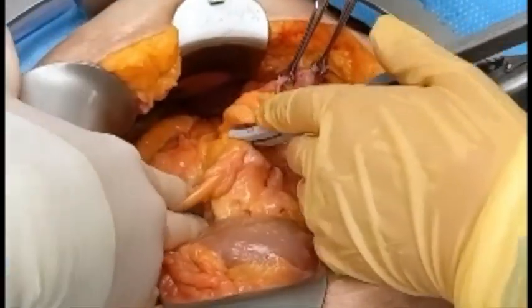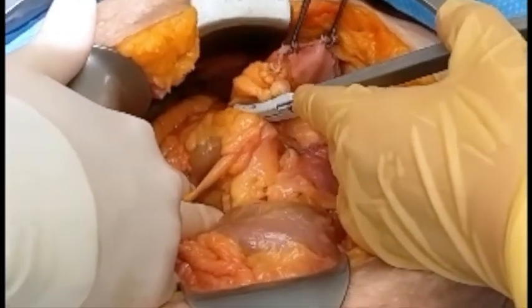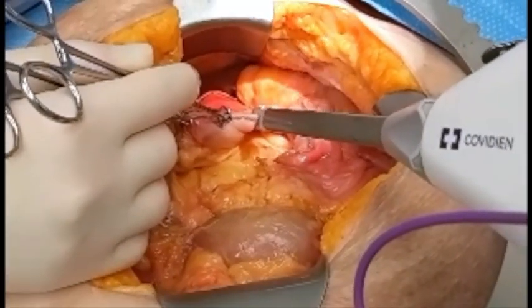The posterior attachments of the stomach to the pancreas are taken down with an energy device, and the stomach is mobilized anteriorly. The plane beneath the proximal duodenum is dissected free to just beyond the pylorus and transected here with a linear stapler.